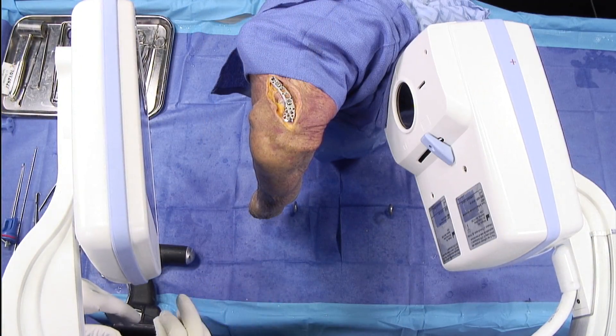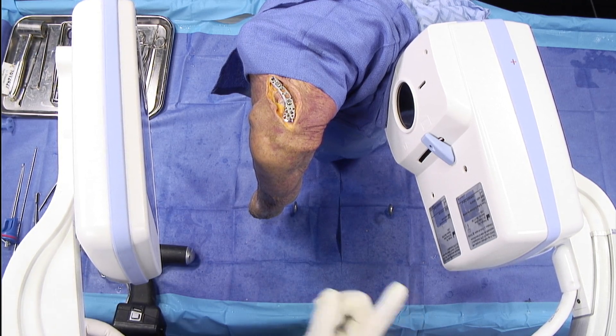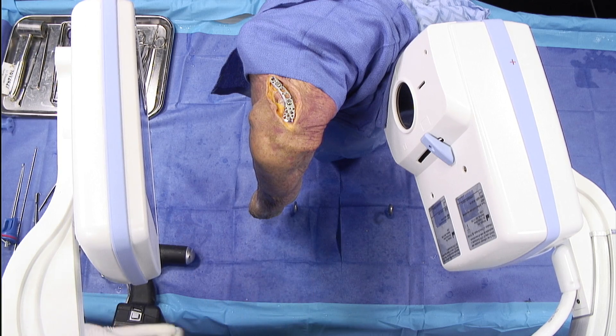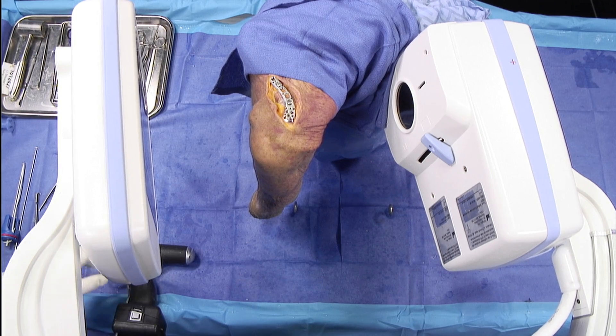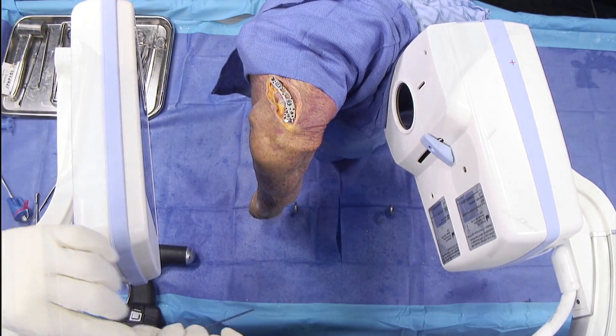We've got a cadaver shoulder, and we've gone ahead and placed a distal clavicle plate with just a couple of provisional screws. Typically I'll do this case in the beach chair position, bring the large fluoro machine in, and step inside the fluoro circle — standing inside the arm and fluoroing from front to back. It only takes a few quick spot views, so radiation exposure is minimal given the fairly simple nature of fixing these fractures.